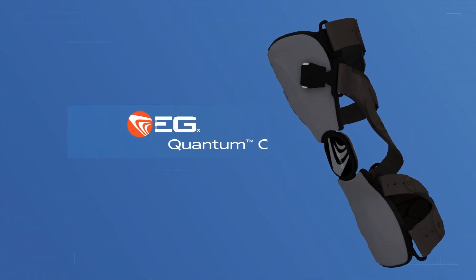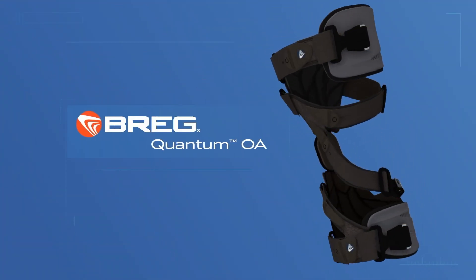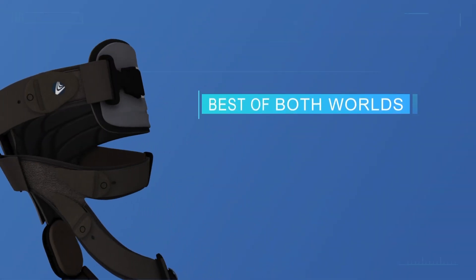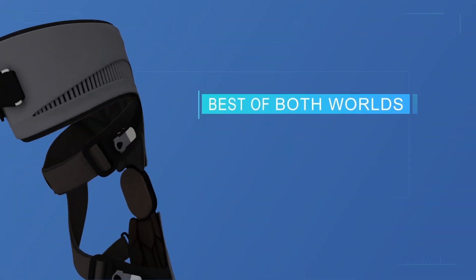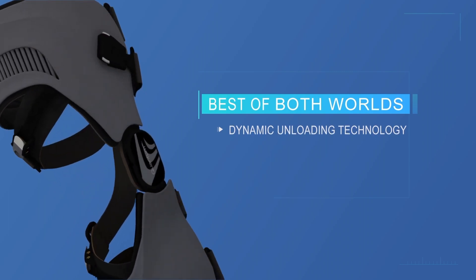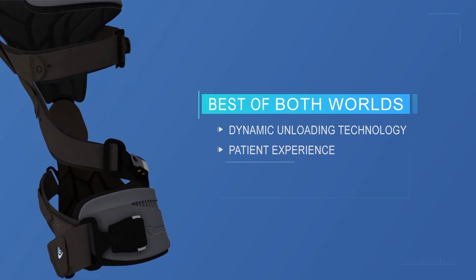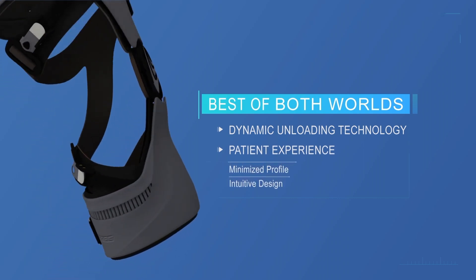Introducing Quantum OA, Gregg's latest osteoarthritis unloader knee brace. Quantum delivers the best of both worlds: number one, dynamically unloading during critical moments of pain, and number two, with an enriched patient experience marked by minimized profile and intuitive use.